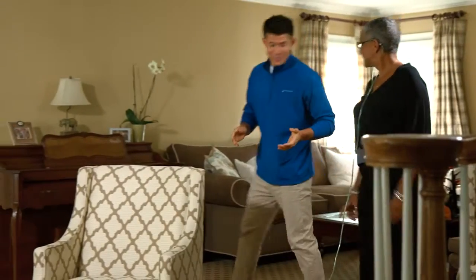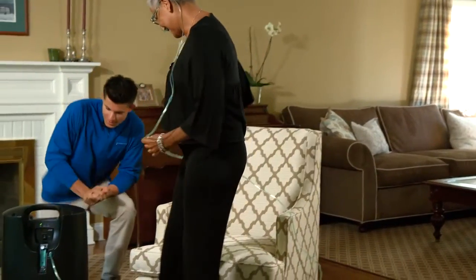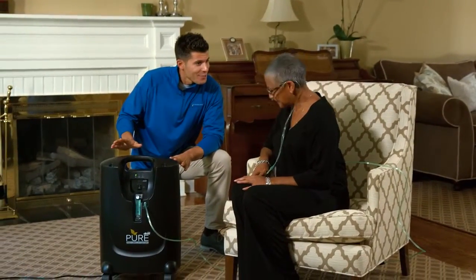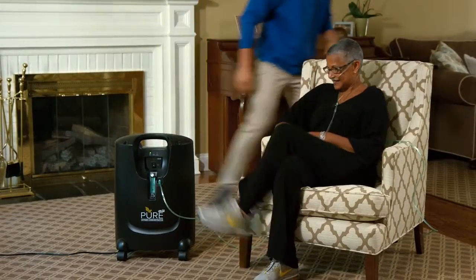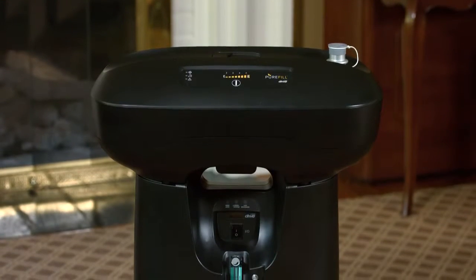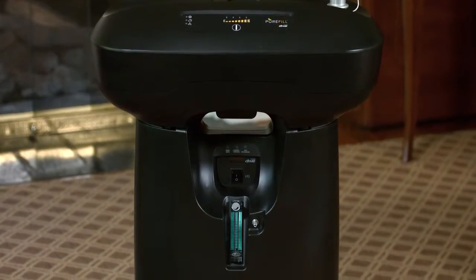When your PureFill is delivered, your provider will help you determine the best location for your unit. Suitable placement of your PureFill is on any flat surface, or preferably mounted on your DRIVE Pure Oxygen Concentrator. If you're using the DRIVE Pure Oxygen Concentrator, you'll have the option to mount the unit directly onto the concentrator.